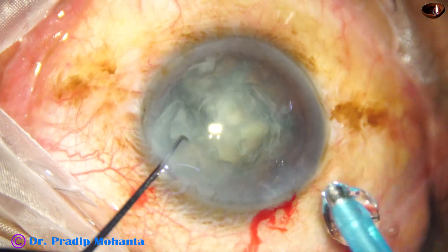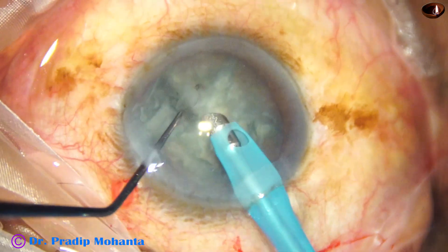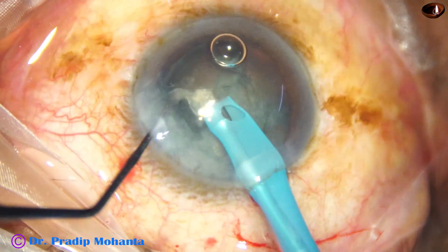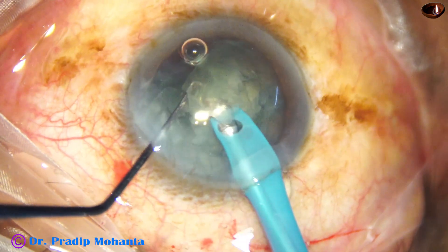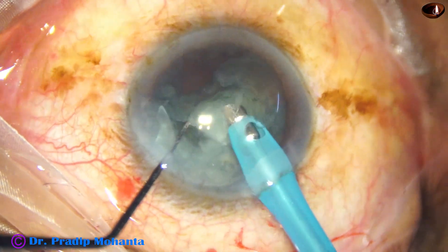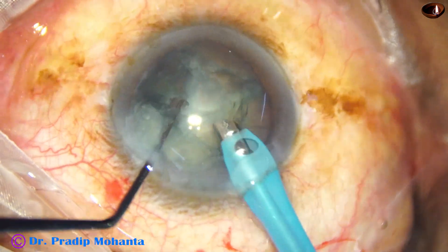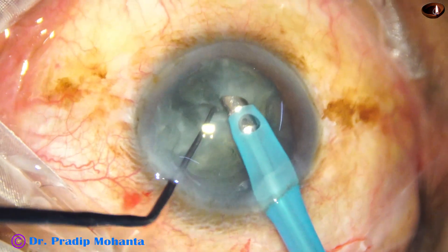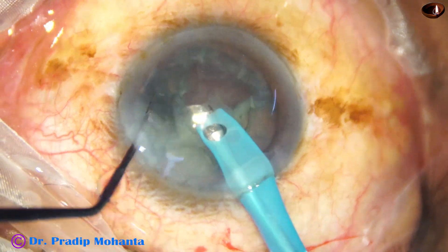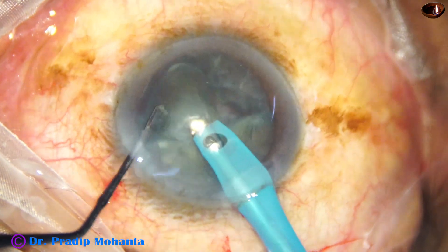When the zonule is weak, rotation of the nucleus is tough. So I have decided to remove the hemi-nucleus which has been divided into three pieces. Here is the first one.